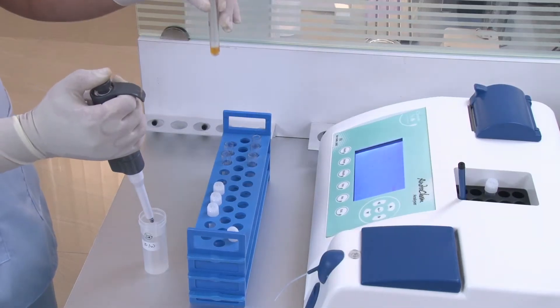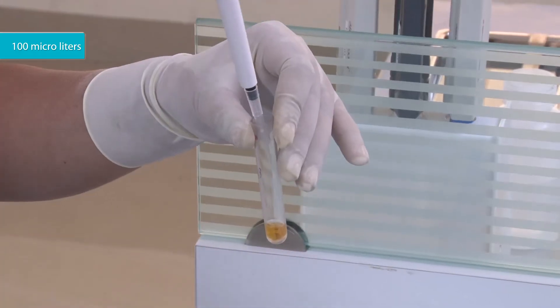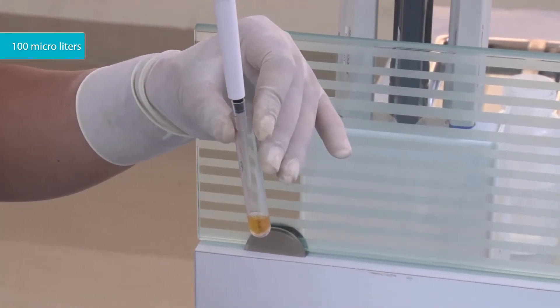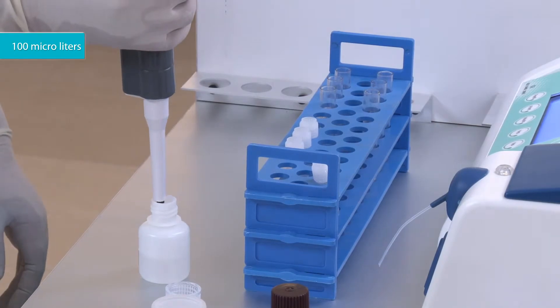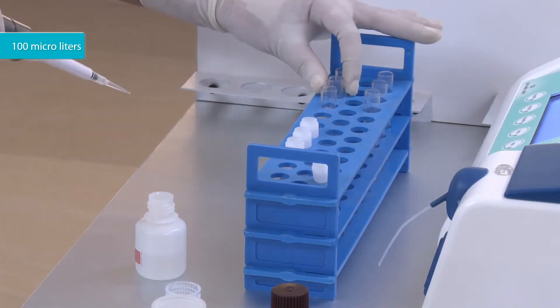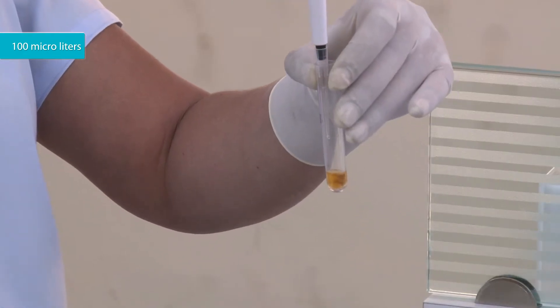Add 100 microliters of normal saline to the tube labeled blank. Add 100 microliters of reagent 3 to the tube labeled standard.